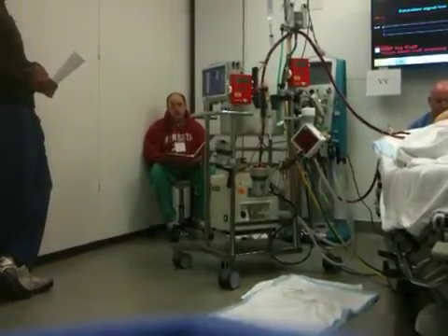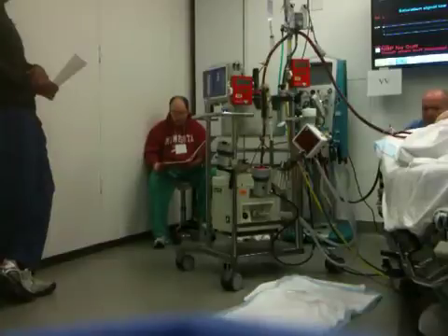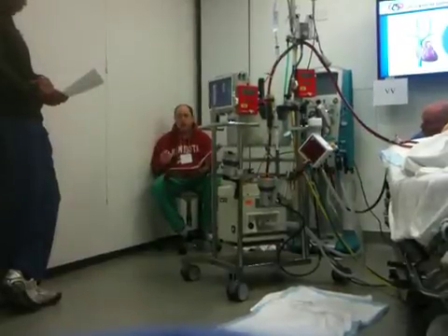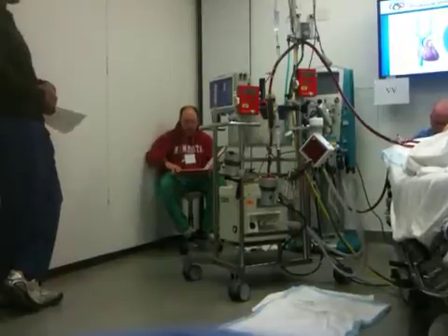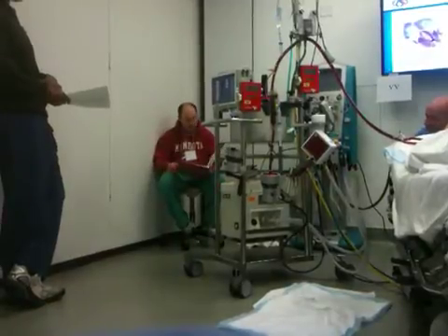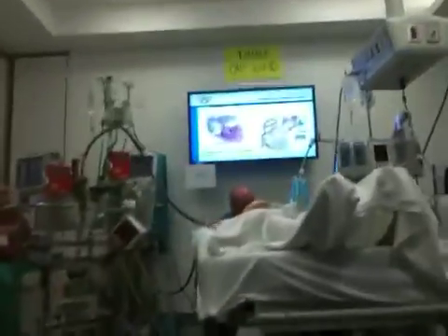Check the venous side to make sure that the air hasn't entrained through the venous side and across the membrane and is going up the arterial side. So you're going to attempt to determine the cause of the arterial air. Be aware that arterial air on VV ECMO is dangerous if there's any type of right to left intracardiac shunt. Communicate in requesting emergency vent settings, call for help, and then the stop point is take patient off ECMO to remove air that's significant.